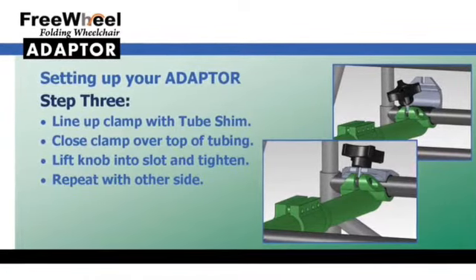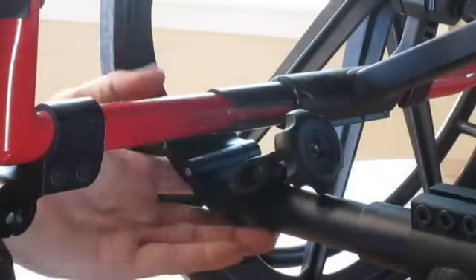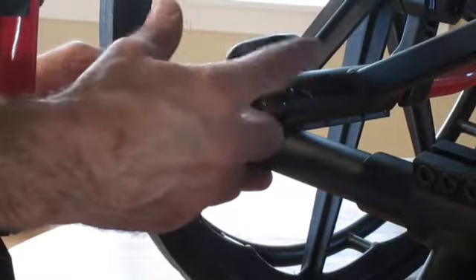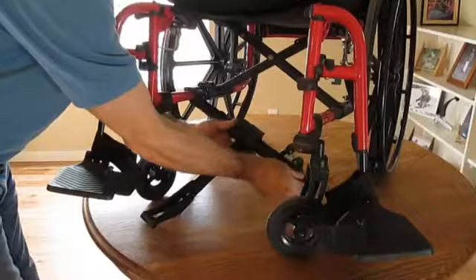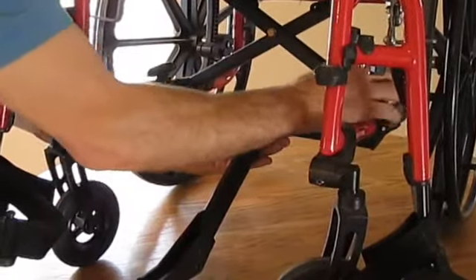Lifting one end of the adapter, line the clamp up with the tube shim and close the clamp over the top of the wheelchair frame tubing. Now lift the knob into the slot and tighten. Repeat this step with the other side. Make sure each knob is securely tightened.